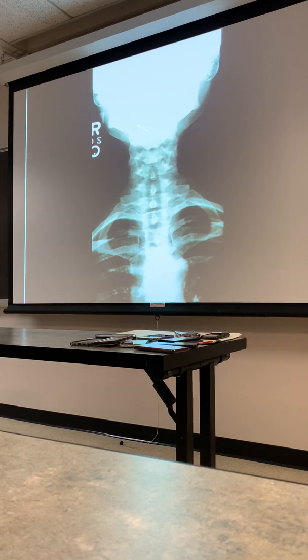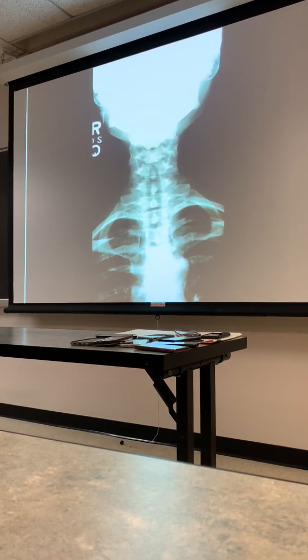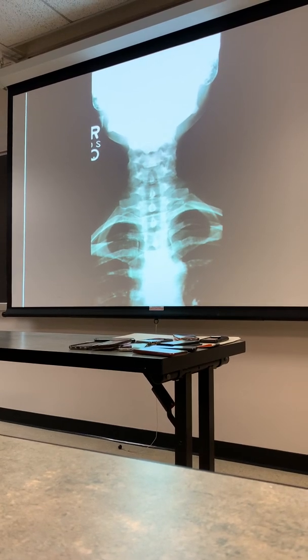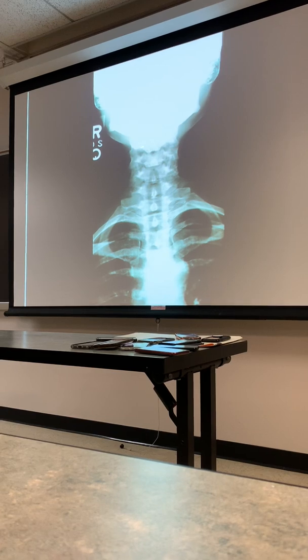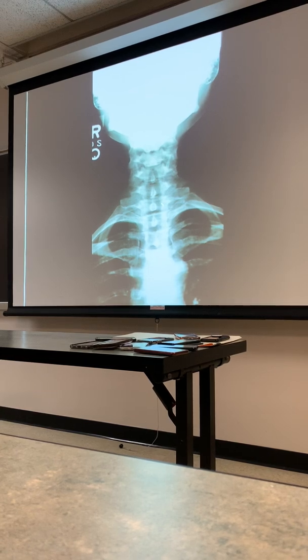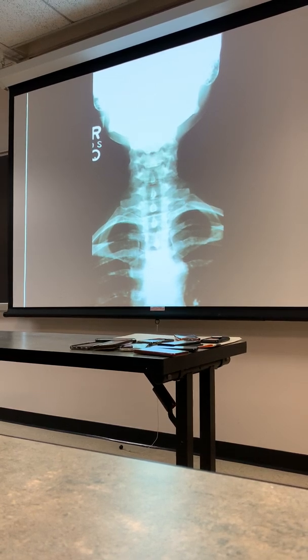Okay. Rotation. Just like any AP spine, no matter if it's L, T or C, what do you check for rotation? Spinous processes. They should be directly in the middle. We can look at the pedicles on the 2 sides to see if they're equidistant, but spinous processes should be directly down the middle. Okay, so what do you guys think about this one?